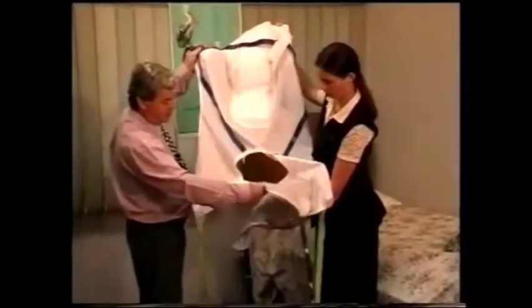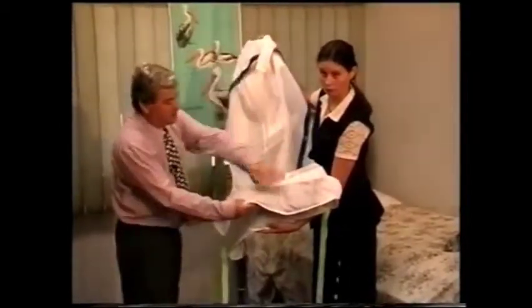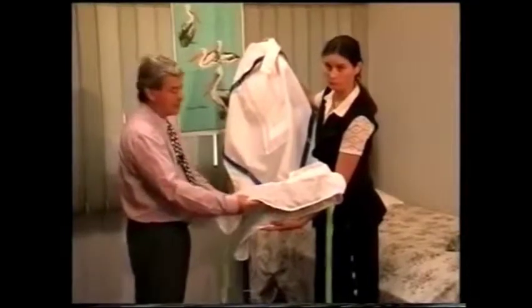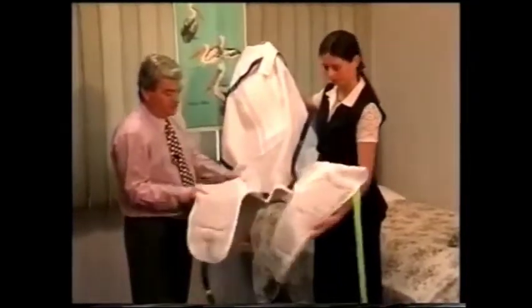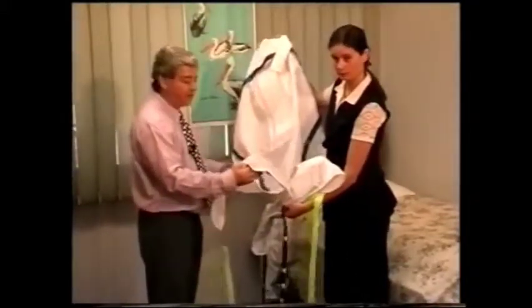Popular sling. You can see how they're sewn on the legs here. They're coming across at 90 degrees from the main body of the sling, as opposed to a general purpose sling where it comes down like that. And the advantage of this is that it's easier to tuck underneath the people.